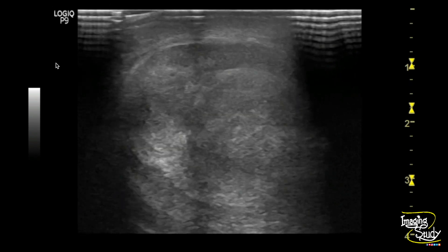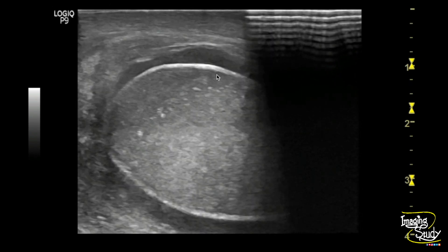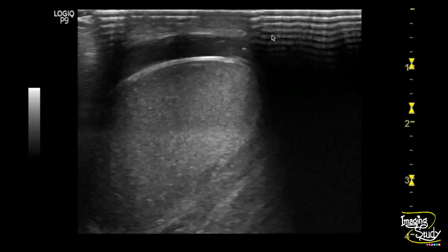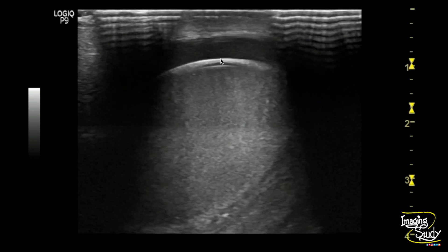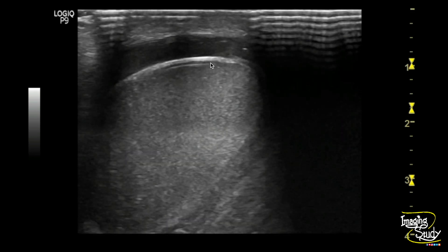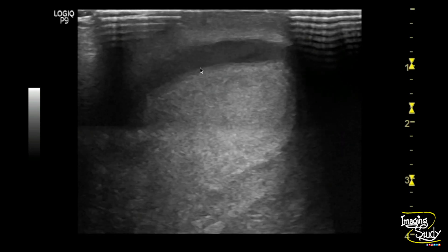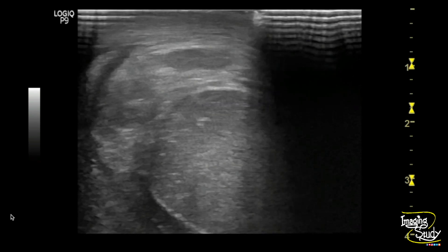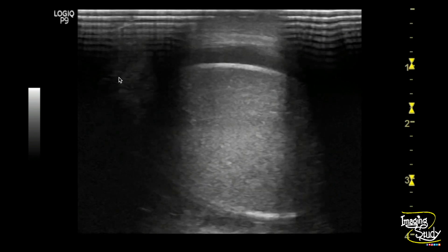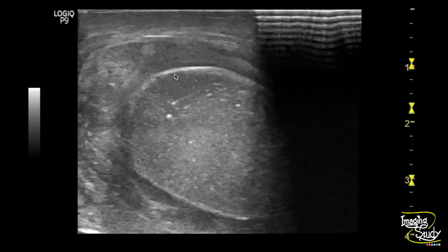Here you can see the left testis of this patient showing a relatively hypoechoic texture with surrounding scrotal skin thickening and some peritesticular collection. The visualized epididymis also appears broad and heterogeneous.